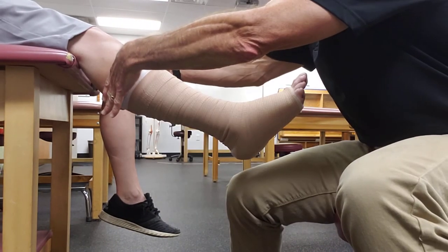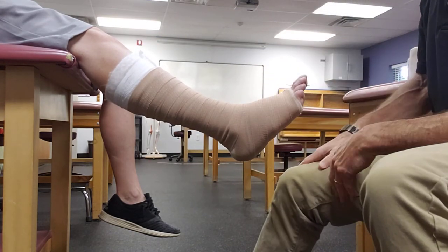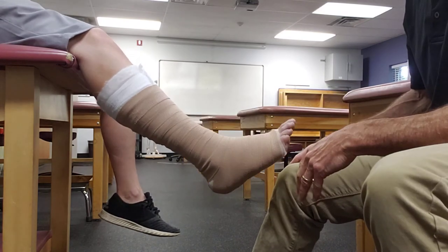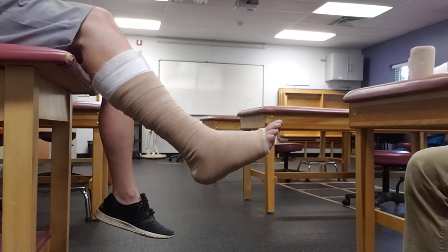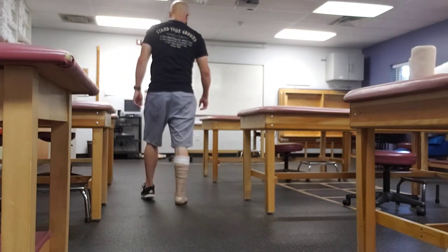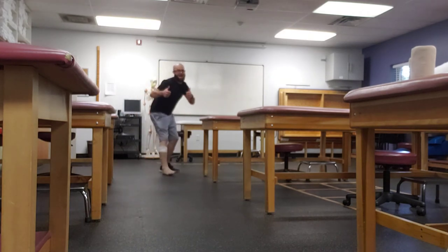If you want, you could put an extra piece of tape on top to secure it a little bit, but otherwise it's good to go. Ideally I would have gone just a little bit higher up on the leg. He could put a shoe over the top of this, but most patients are not going to have normal-girth legs — they're going to have really big legs if you're using this. He's at basically a 90-degree angle. I did leave a little spot on the heel exposed, so I'd need to make sure I captured that.